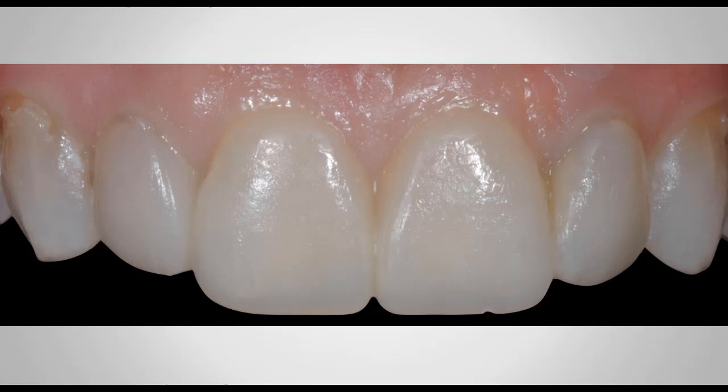Then I remove the clear triad, leave the clear PVS, cure one more time, 20 seconds per tooth. Then I remove the clear PVS and go directly onto the flowable composite and cure one more time, 20 seconds per tooth. And this is immediately after removal of that clear PVS. You can see that this is completely polymerized, and look how thin the flash is. Very easy to identify, very easy to follow the gingival margins of these teeth.